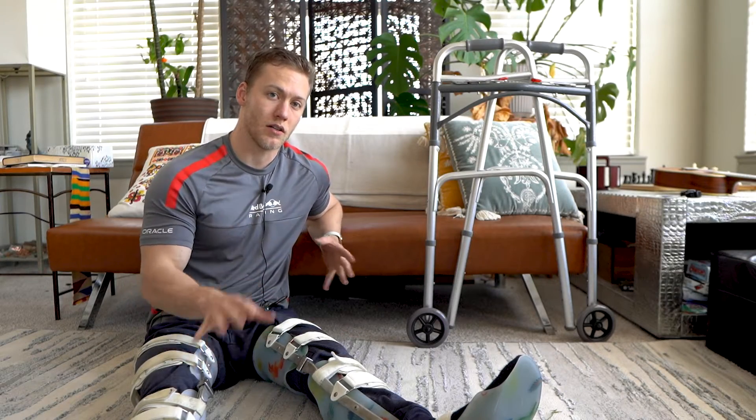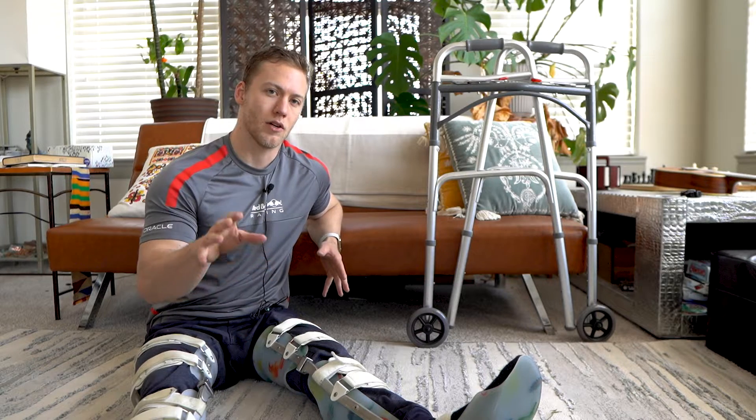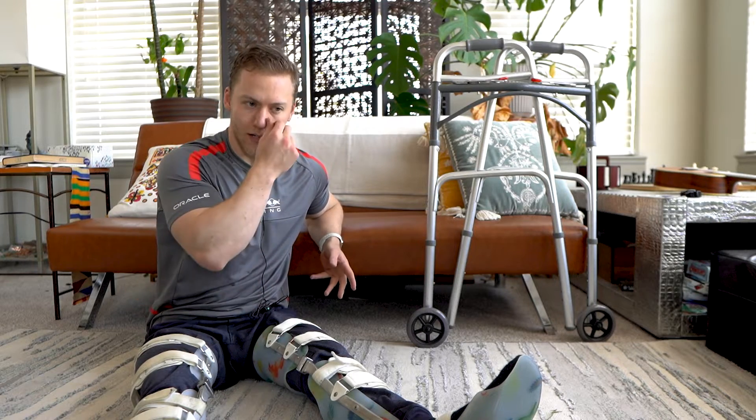Welcome back everybody. I just recorded a video about how to put on and take off leg braces. I hope you watched that one, and now we're going to stand up and walk in leg braces.